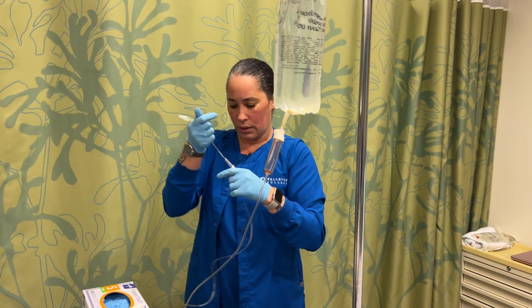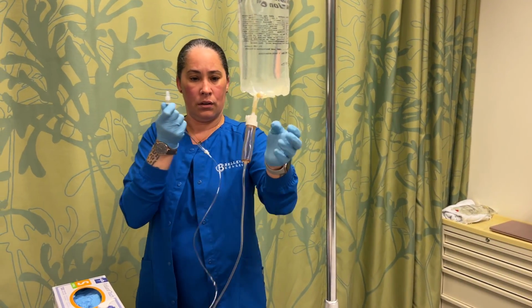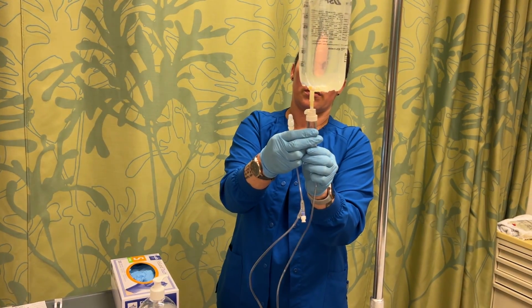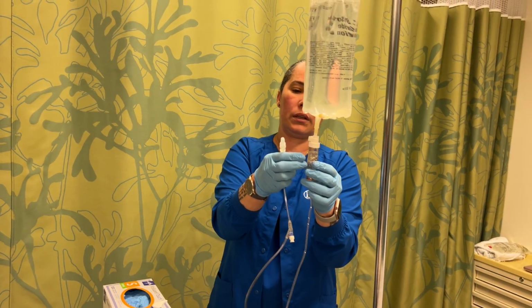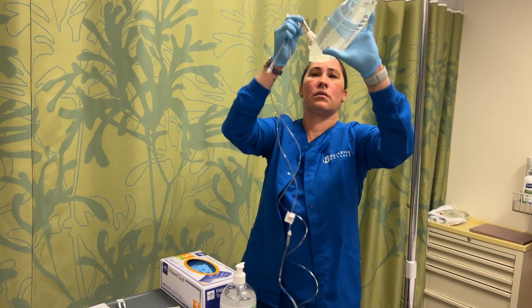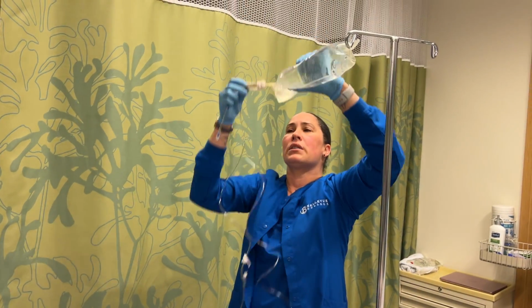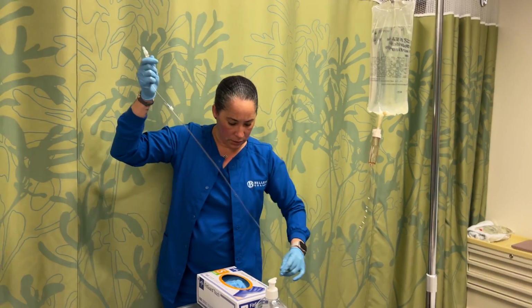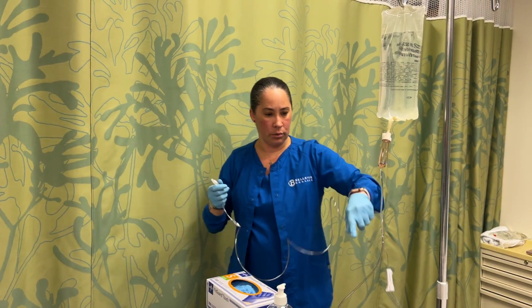Okay, so now that we have that in, I'm going to prime the chamber. You want to fill it about 3/4 full. This will prevent bubbling later. If you feel like you've done too much, you can always flip it, put some of it back, and make a little more room. All right, so next we're going to prime the tubing.